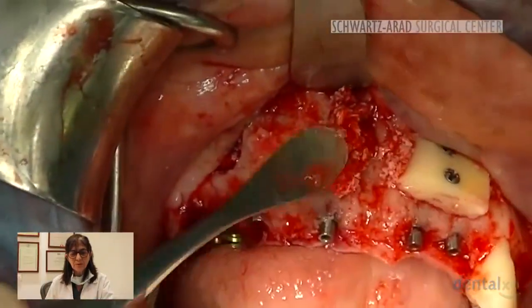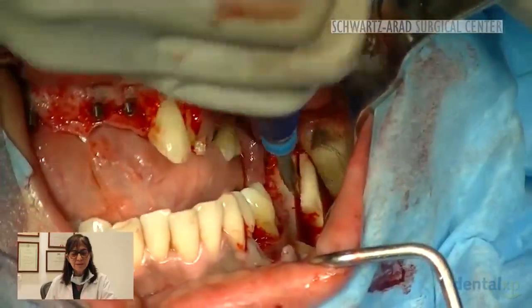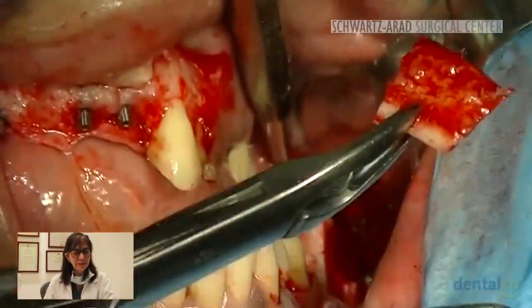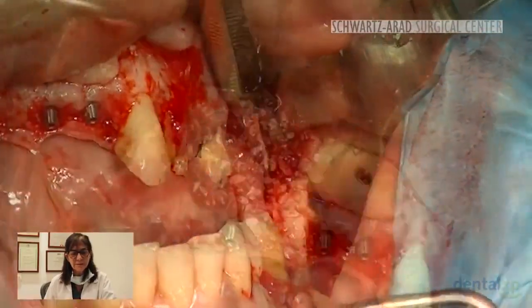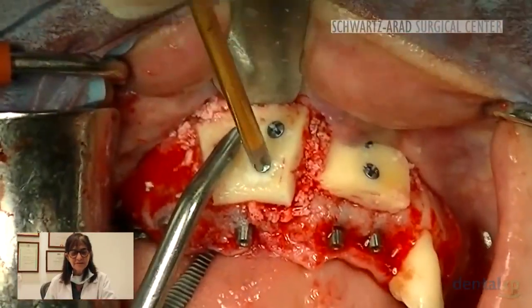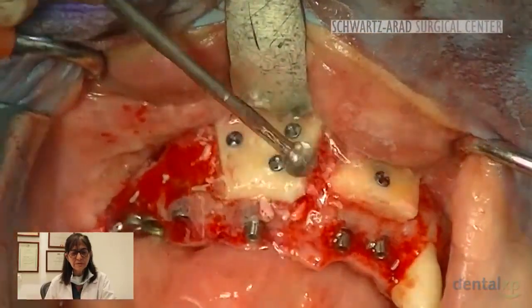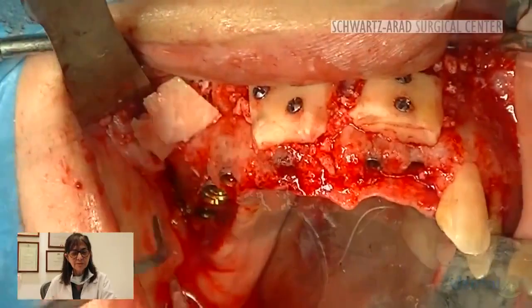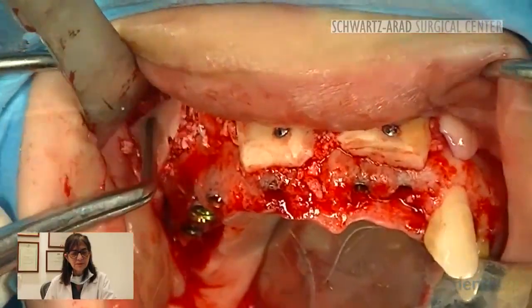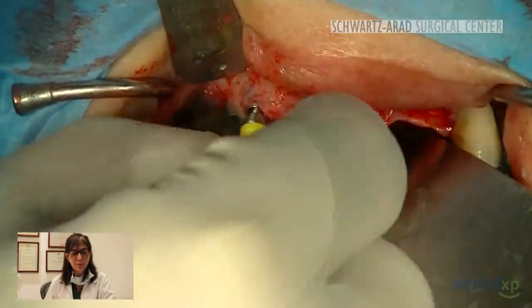So I use the bone substitute mixed with platelet-rich plasma, and then I harvest the second block and use it for the right maxilla, and then fix it with a few 1.5 self-tapping screws, and then I use the window to close the lateral opening.